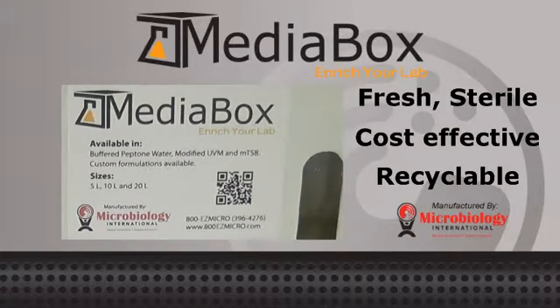MediaBox is available with a wide variety of media, including buffered peptone water, UVM, and phosphate buffer in 5, 10, or 20 liter sizes.